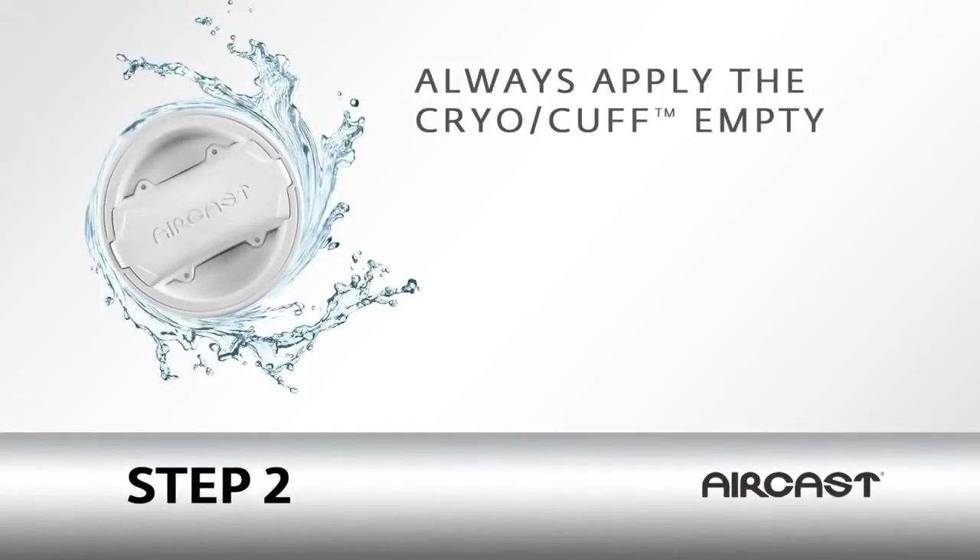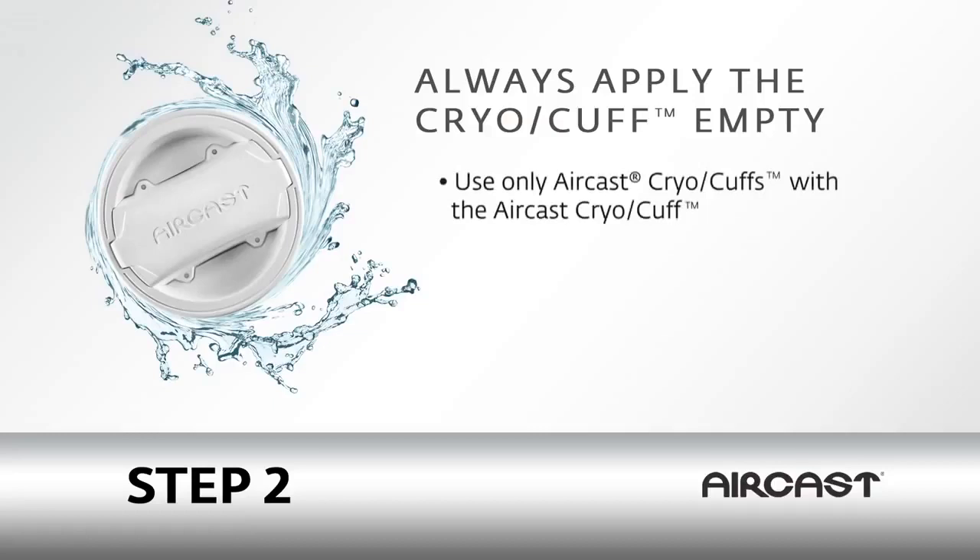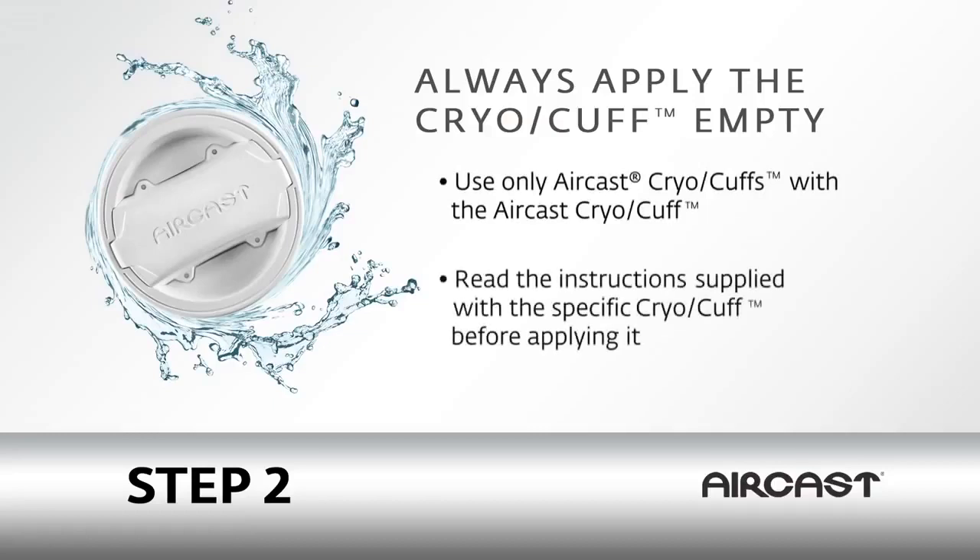The Aircast cryo-cuff gravity unit is designed to work with the Aircast cryo-cuffs only. Be sure to carefully and completely read the instructions for your specific cryo-cuff before applying it.